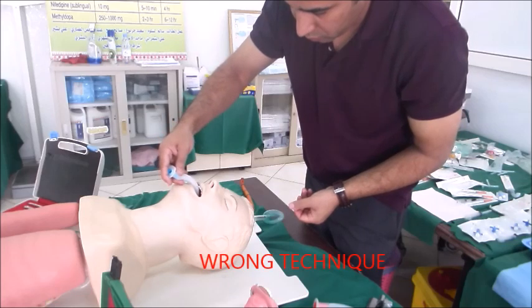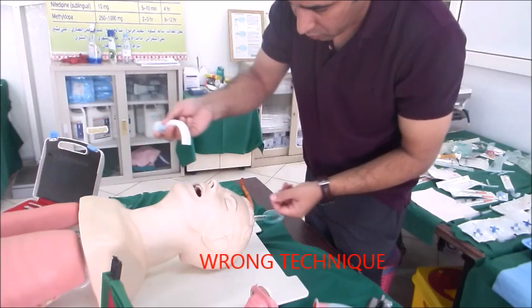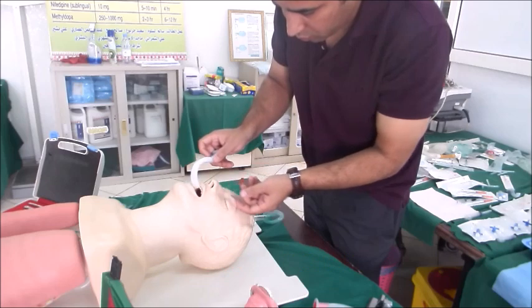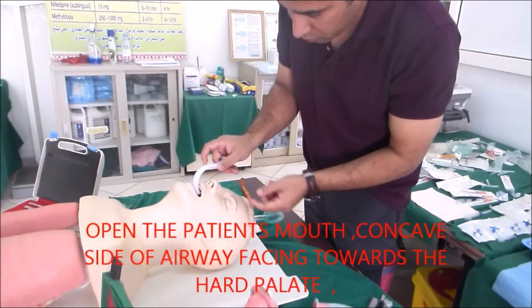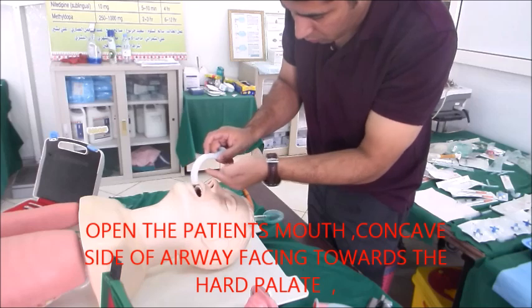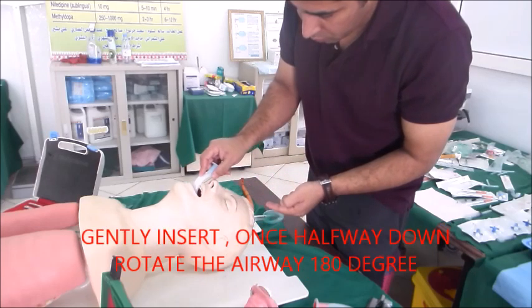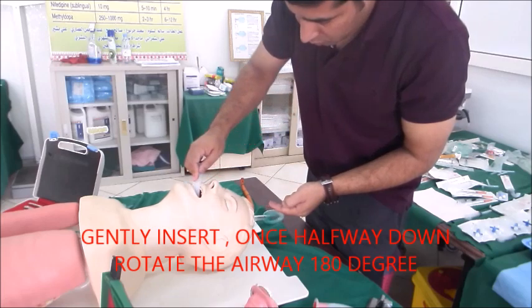This is the wrong technique — we do not keep the concave side facing downwards. The concave side of the oropharyngeal airway must face towards the hard palate. Gently insert it with the concave side facing the hard palate.